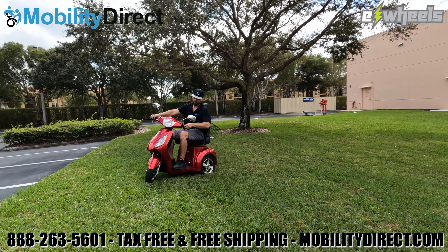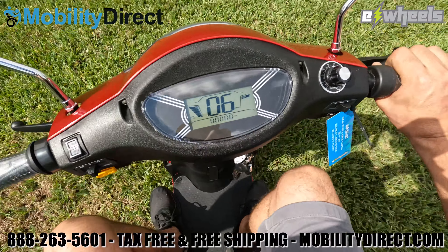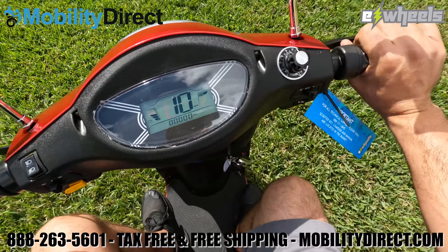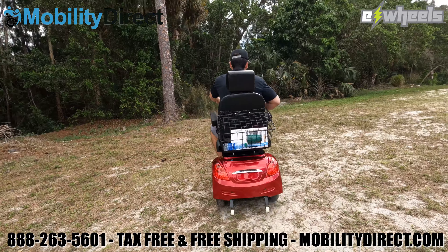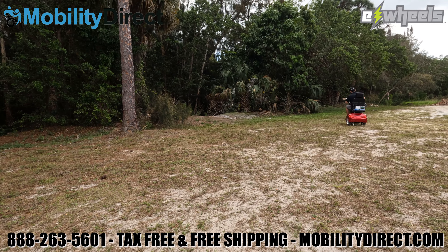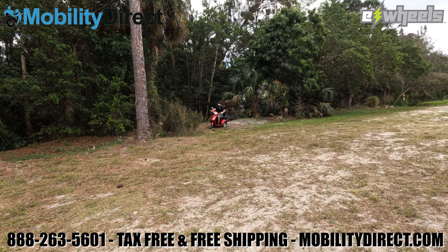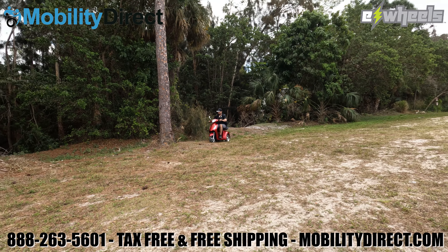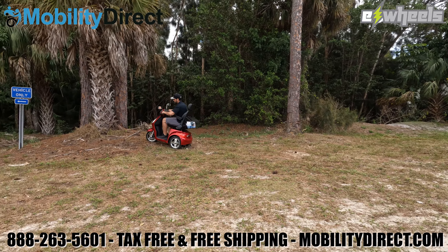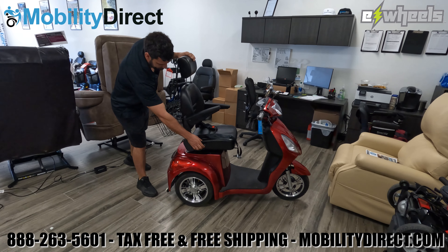Hello and welcome to today's YouTube video tutorial. Today we have an EW36 scooter by eWheels and we're going to show you how to take it apart almost all the way down to the nuts and bolts. The only thing we're not going to do is show you how to remove the motor, how to change the wheels, and how to adjust the brakes. We will put a separate video up for that. In this video we're going to show you how to access all the electrical components so that you can troubleshoot the EW36.